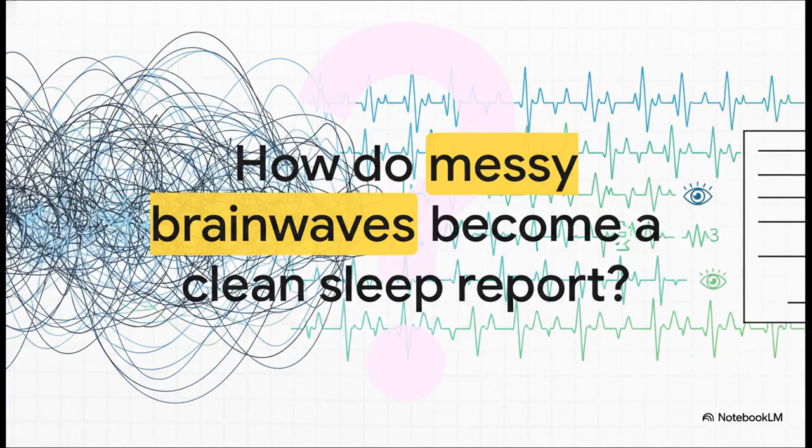You ever see those images from a sleep lab? It's just a bunch of chaotic, squiggly lines scrolling across the screen all night long. So, how on earth does a sleep tech look at that and turn it into a clean, structured report that actually tells the story of how someone slept? Well, that is the puzzle we are going to solve together today.